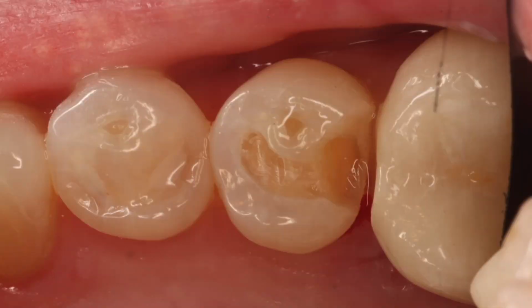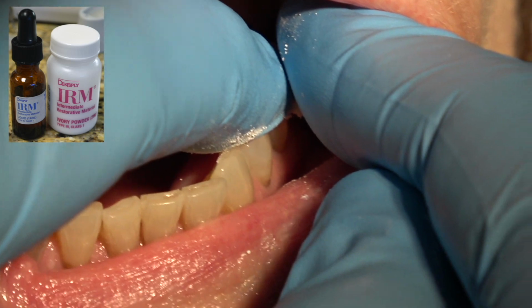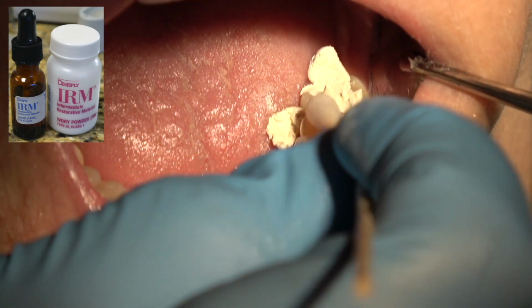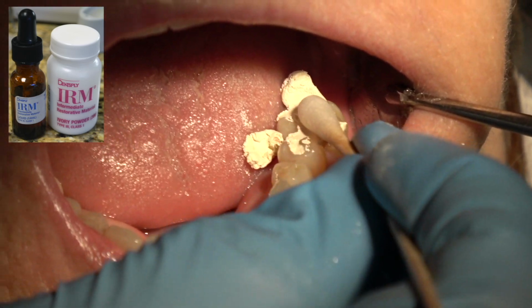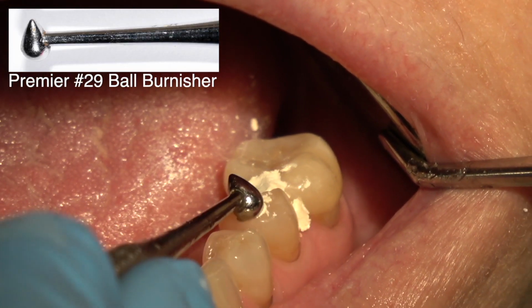Here's my prep, and I'm going to place IRM as a provisional restoration. You can watch the video on how to mix the IRM. You want it to be pretty stiff. You don't want it to be gooey. This is just perfect for a provisional restoration for an inlay.